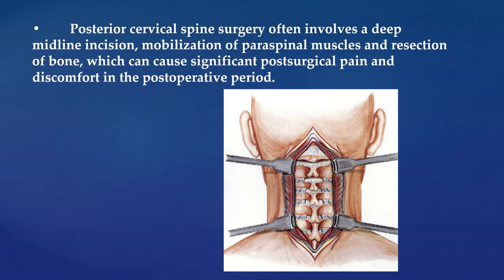Posterior cervical spine surgery often involves a deep midline incision, mobilization of paraspinal muscles, and resection of bone, which can cause significant post-surgical pain.